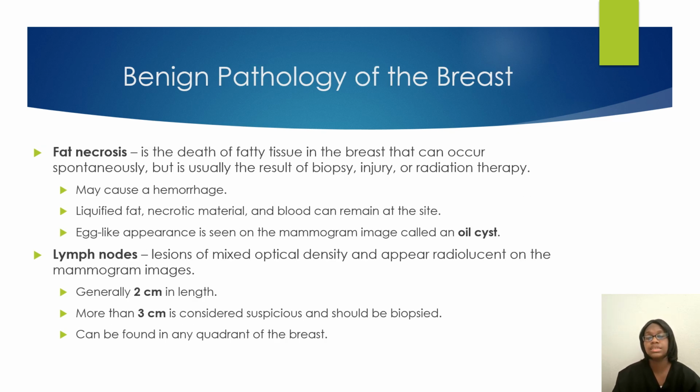Fat necrosis is the death of fatty tissue in the breast, which can occur because of an injury, a biopsy, or radiation therapy. It may cause blood along that area and form an oil-like cyst or egg-like appearance on the mammogram images. You also have your lymph nodes.